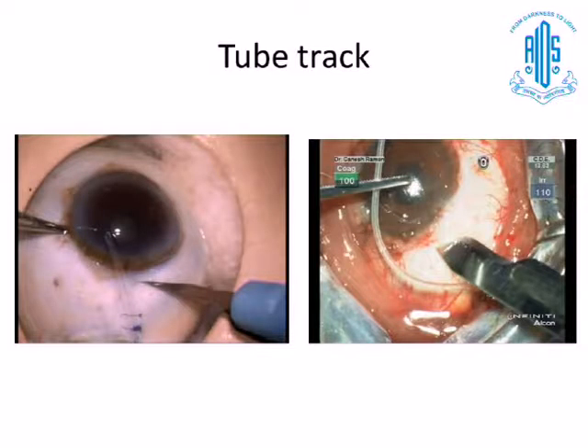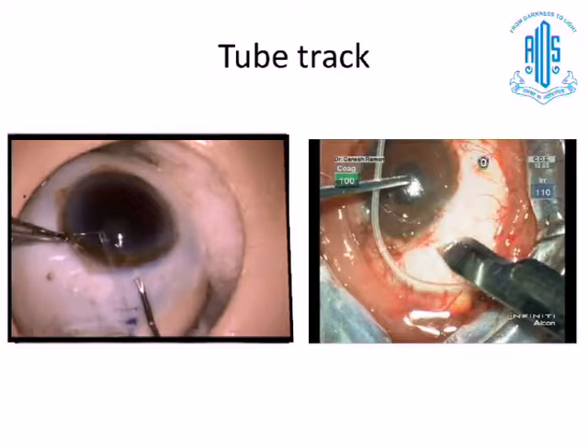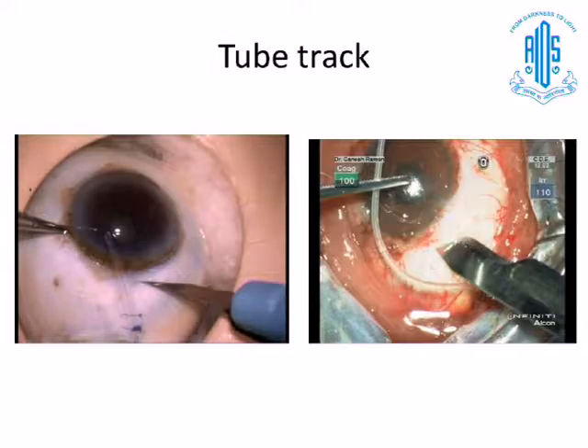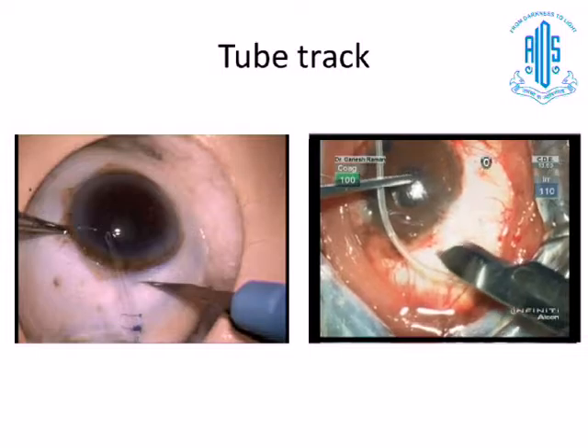Creating the tube track is also very important. You can plan how to create the track — what is the correct partial depth, how far behind the limbus you want to do it, whether three or four millimeters, whether you want a longer or shorter track. You can deliberately insert the tip of the needle slowly, and you can even feel the tip of the needle as you are inserting the tube inside the anterior chamber using a forceps.